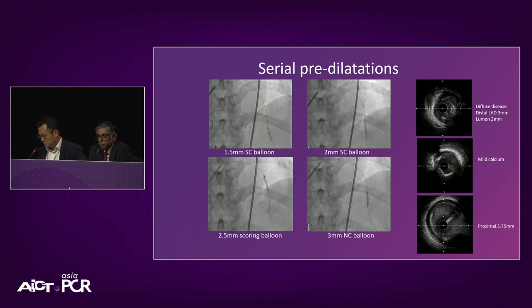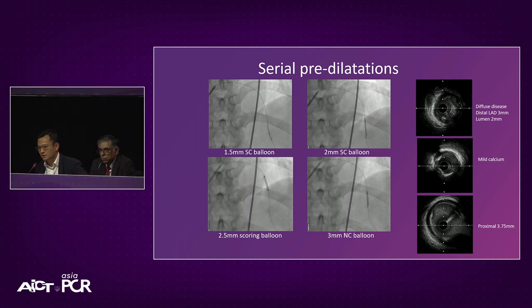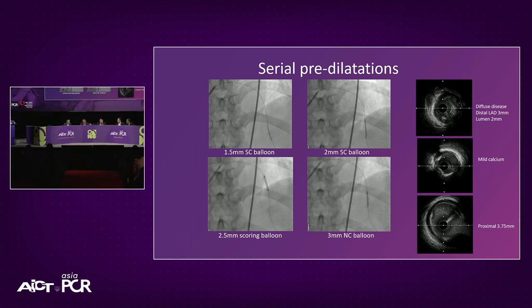How much calcium before you adjudicate whether the DCB is a good choice? Is that a factor at all? Yeah, that's a great question. I don't think that we have a score for that. We have scores for how difficult it is likely to be to get a good stent result, but we don't have a score for what is good for or better for DCB versus DES. So I don't have an objective answer for that, to be honest. So Rosli has IVUS eyes, so he doesn't need IVUS.